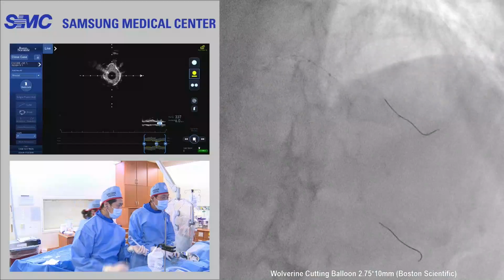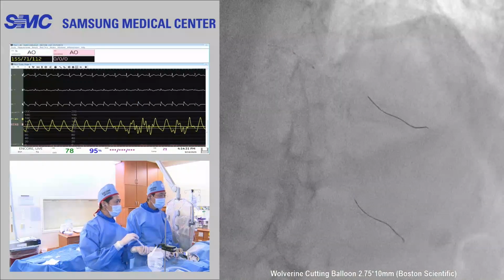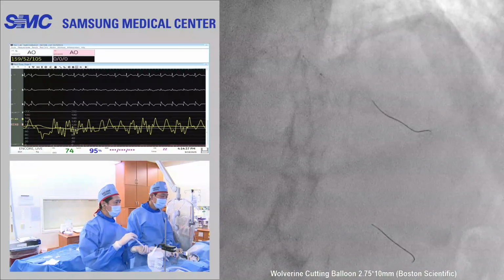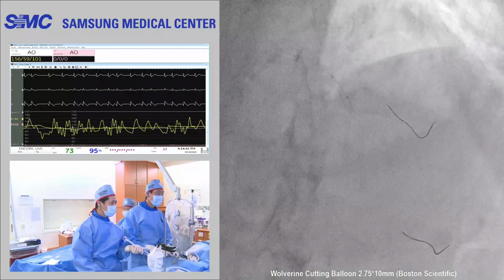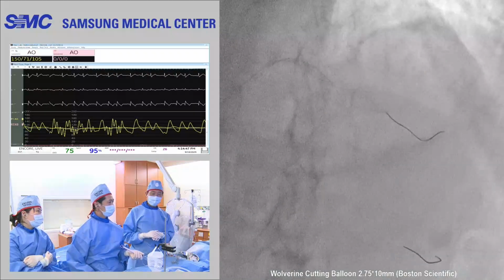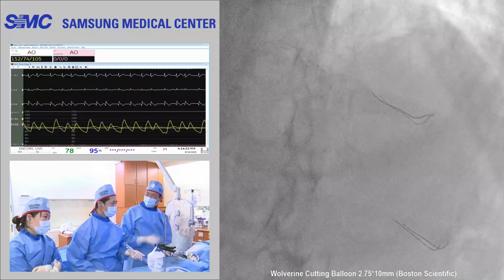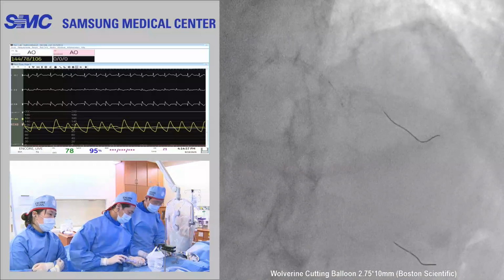Please hold the guide. Oh, there is a lot of resistance here. Because we always call the cutting balloon a rice cake in the picture. Okay, oh, it passes. Like sliding on a rough surface, rough asphalt. It feels like that. So it's very, okay. One. Yeah, wait, stop.